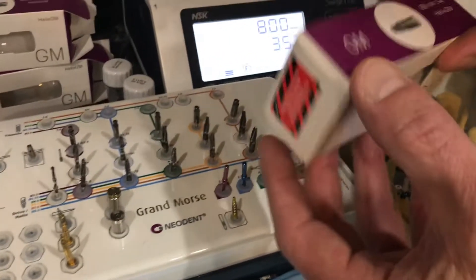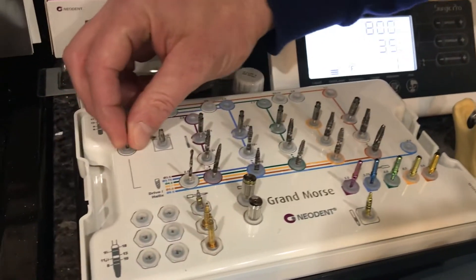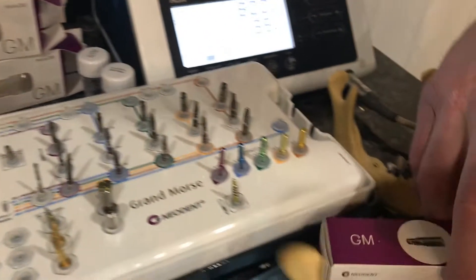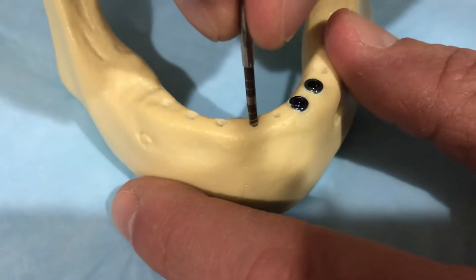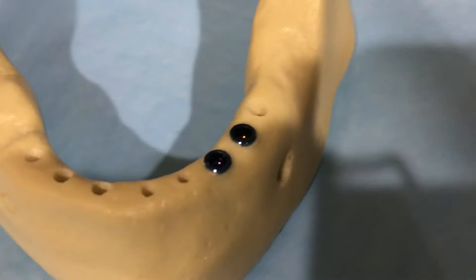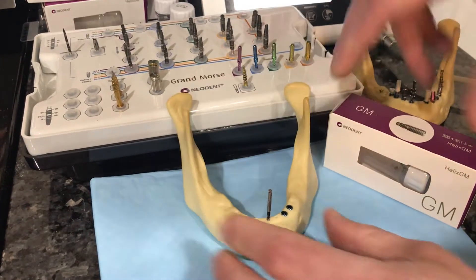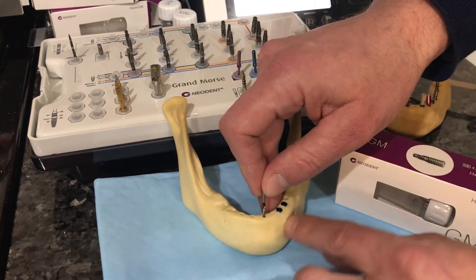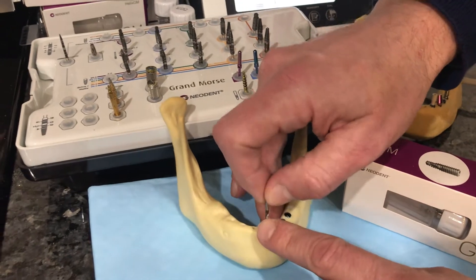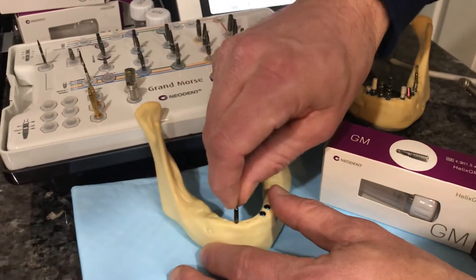Today the implant we're going to use is a GM Helix 4.3 by 11.5. Going back to the kit, we have a spear to get started initially into our osteotomy. I've already pre-drilled some holes — you take the spear, create a hole on the ridge, then switch to the 2.0 drill. I went to 13mm depth in the anterior mandible with the 2.0 drill, and then the next size drill up is the 3.5.